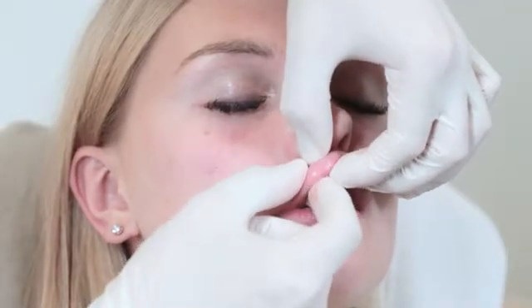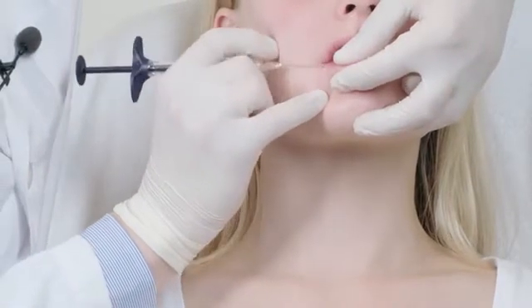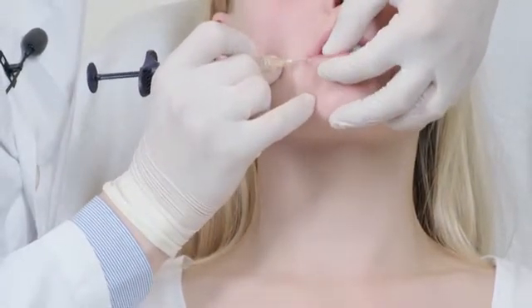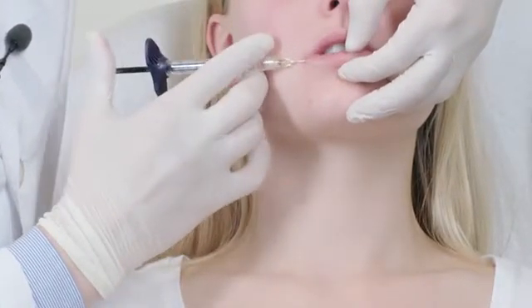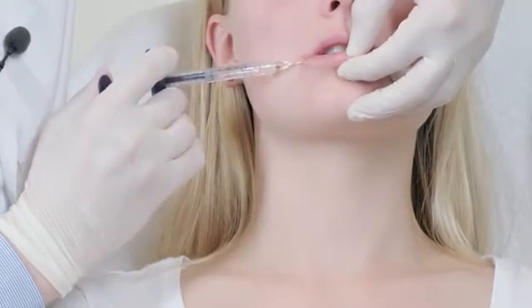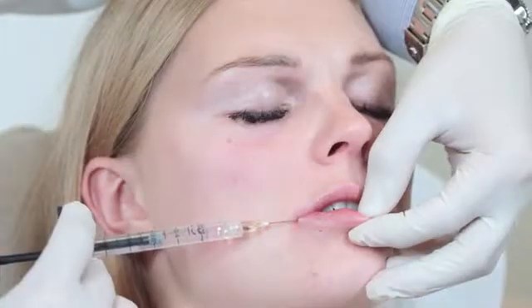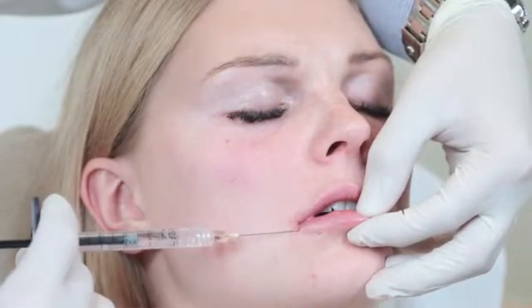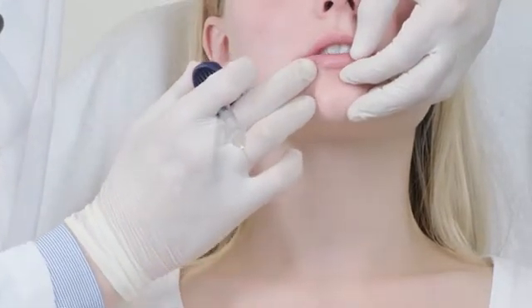Now let's go on with the lower lip. In the same manner as the upper lip, I inject the lower lip by creating a horizontal plane for the cannula to glide on, just until the midline of the lip. Once I've reached the final point, I press my thumb against the tip of the cannula and inject a small bolus stretching from the midline until a line through the ala of the nose and through the lower lip. This way you create a very natural looking, nicely everted lower lip.